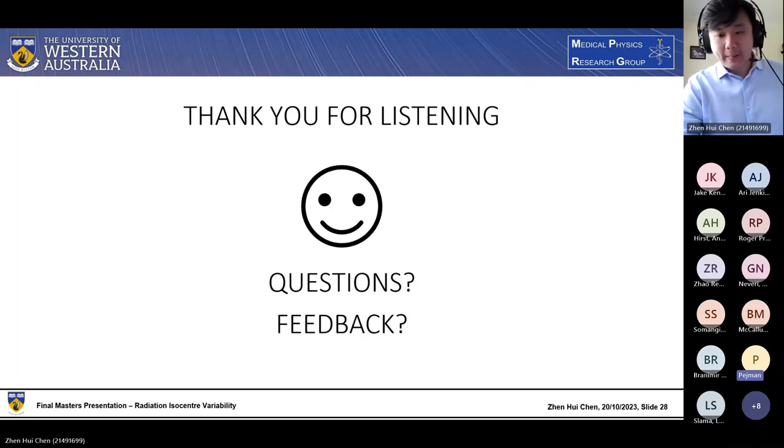Yes, thank you, Zhen. I have a question about how your findings compare to Elekta's recommended angles. Do you know what they recommend for commissioning of the machine? Yeah. So, to the best of my knowledge, there's actually no recommended angles for commissioning. The starshot pattern is usually taken at cardinal angles, and at best it's taken at every 30-degree interval. But most of them refer to TG198 and 142, and in that it just recommends a commissioning or an annual QA interval of 30 to 45 degrees.